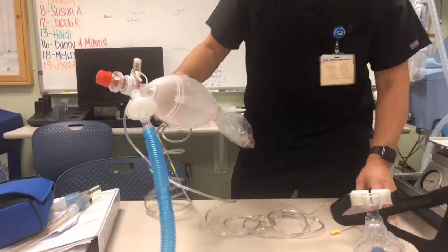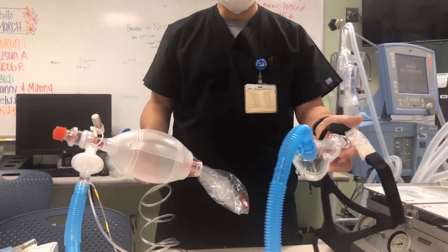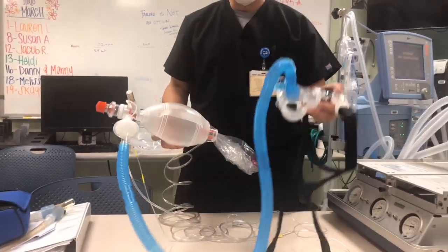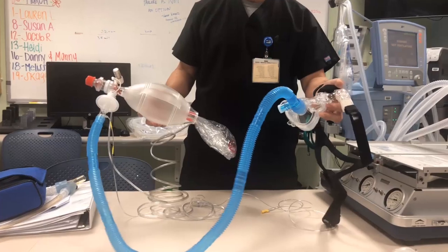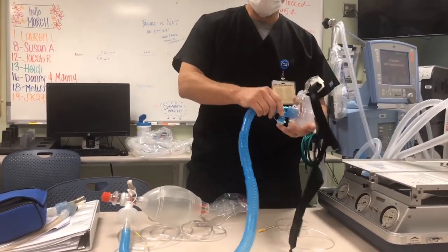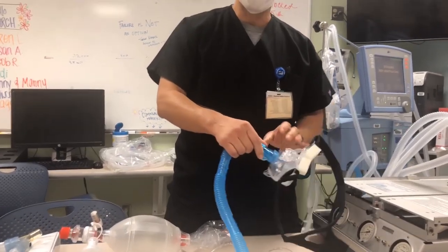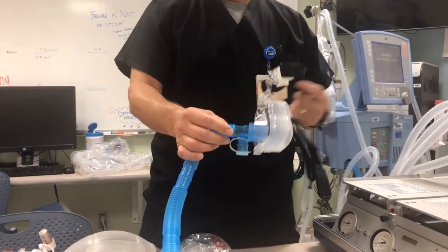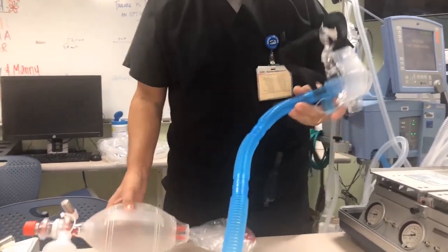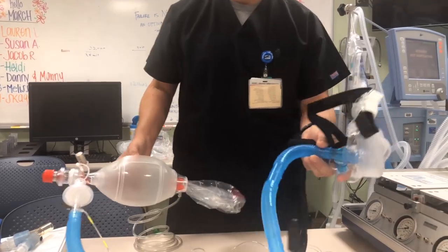The rationale here is: if we're out of MDIs and a patient is in distress, you want to give them a continuous breathing treatment. You want to do it so that no aerosol comes out of the mask or the system, because it could contaminate other people with COVID-19. The idea was to give positive pressure while giving a treatment and not exposing staff unnecessarily.